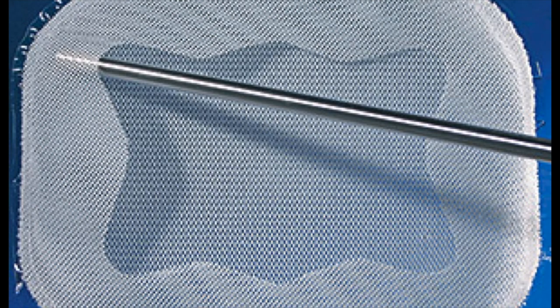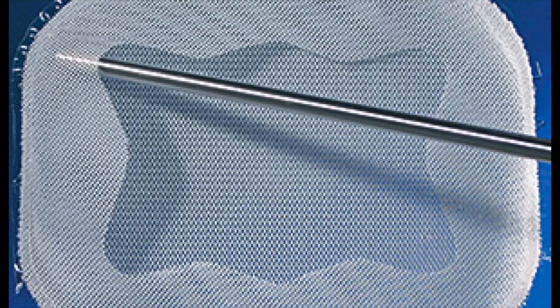The mesh was secured with four prolene transfascial sutures at the four cardinal points. A double crown was then made with secure straps. This was done under reduced pneumoperitoneal pressure without tension. At the end of the procedure, the mesh adequately covered the defect.